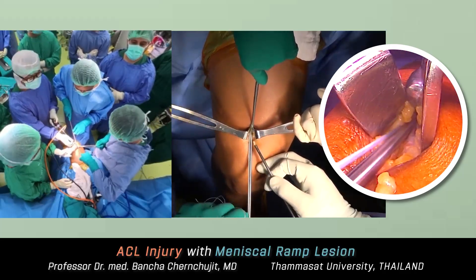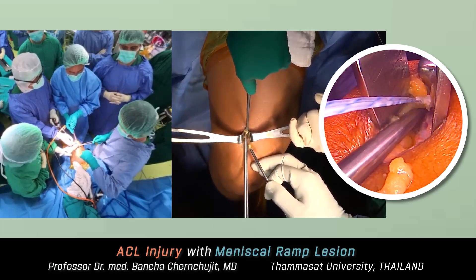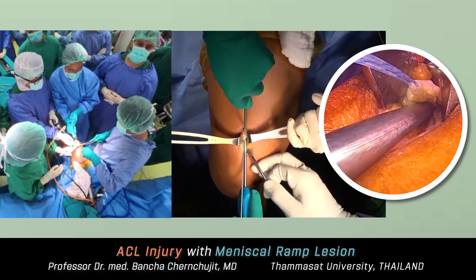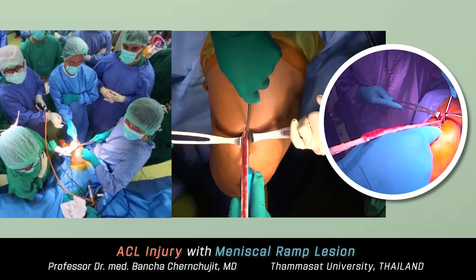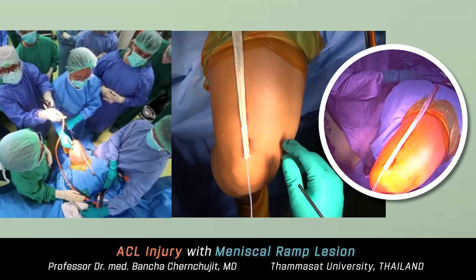This is a hard tendon stripper, about seven millimeters in diameter — very stiff. The direction is toward the anterior superior iliac spine; this is safe and you'll never injure the femoral neurovascular structures. The harvested graft is very long — at this length it's enough for both ACL and PCL reconstruction.